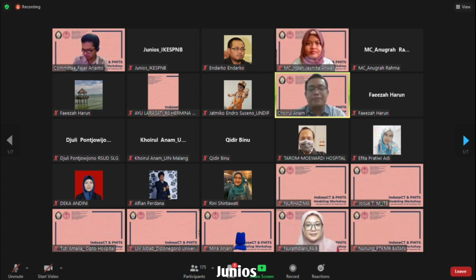It means that if we calculate the SSDE and use the size conversion factor, the scatter is actually included in this size conversion factor. However, globally, we do not see locally and we do not see very detailed, but globally. But actually, the scatter radiation is included within the size conversion factor, like that.